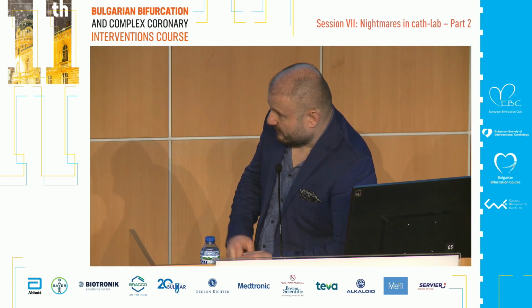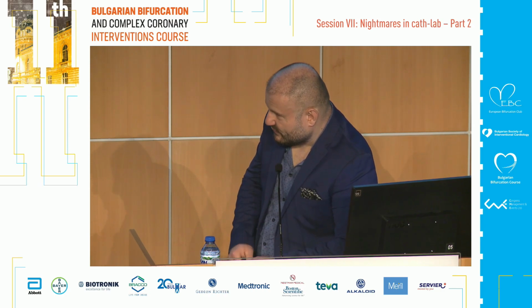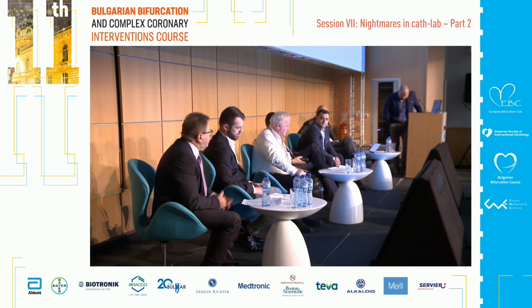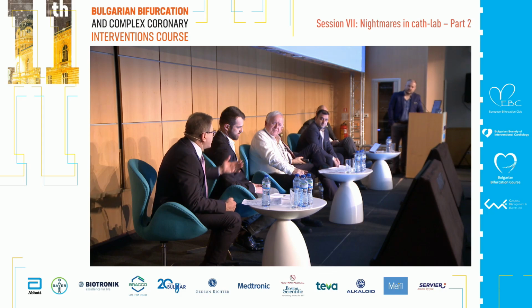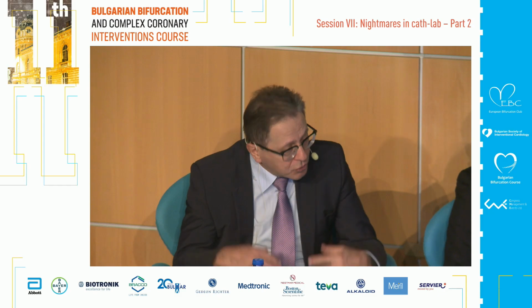But after 1 month of stent implantation, there was an idea of so-called temporary stents, also drug-eluting. The problem was always how to get it back. So you did it by chance. So you could use this. That would be a great case to show other people that in such a situation, this is also an option: not to stent.